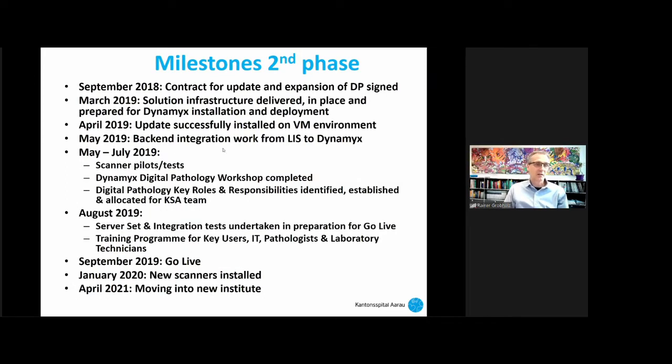But luckily, we had a company that took over the GE software, and in 2018 we could sign a contract with this vendor, and we could save all our data and continue with the digital pathology. However, that required an update. And again, as you see, to make all this update and set up all the new interfaces took us almost another year to get this all done.